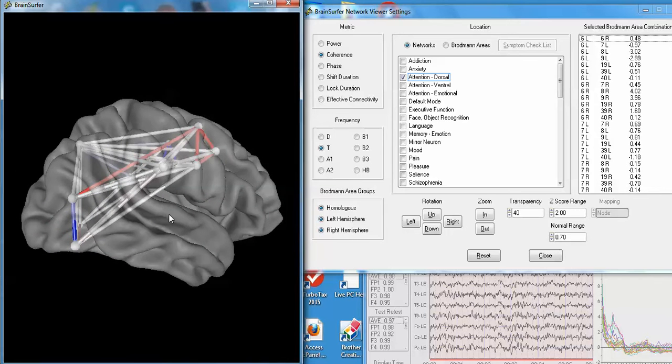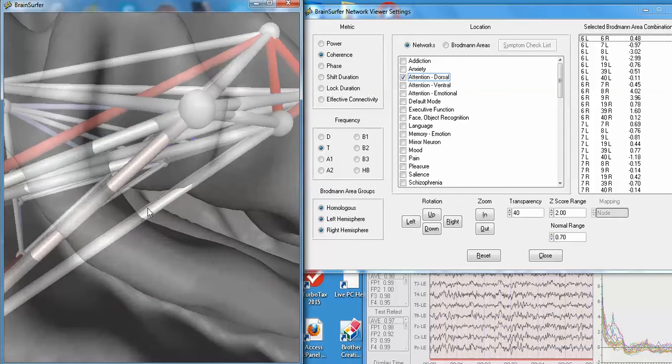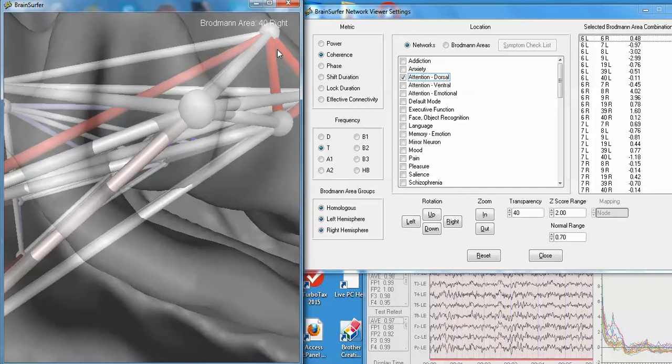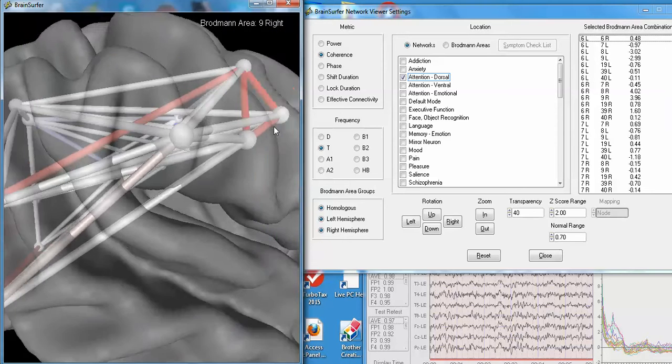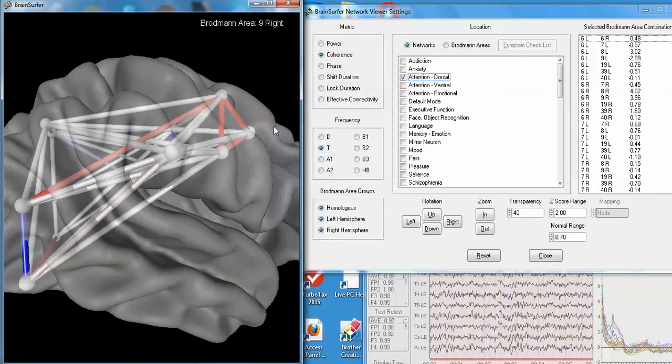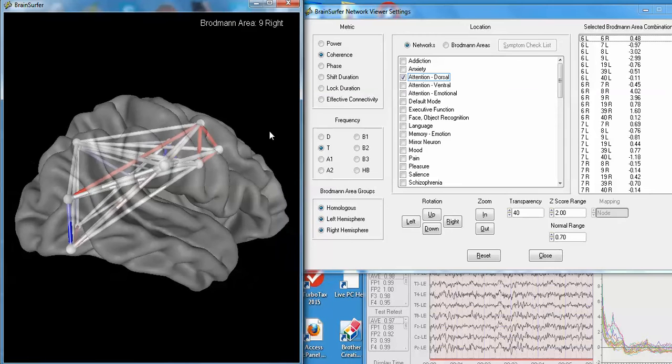Now I'm going to zoom in. We can go all the way in and we can look at, that's Brodman area 40 right. This is the connections between Brodman area 6 right and Brodman area 9 right in the frontal lobes of this patient.